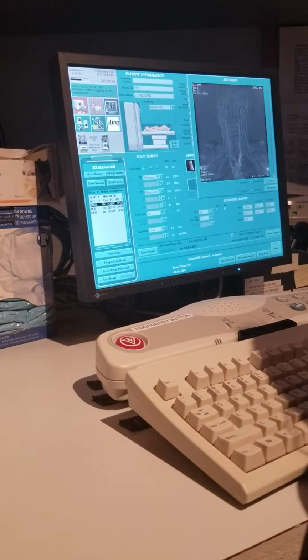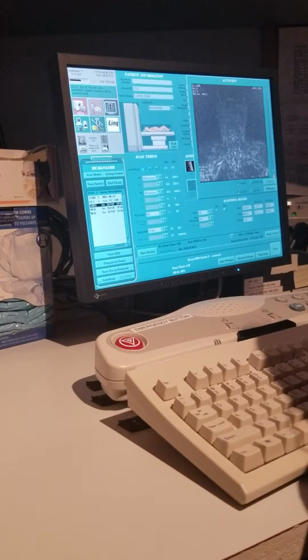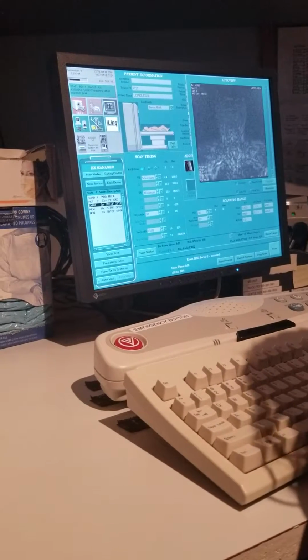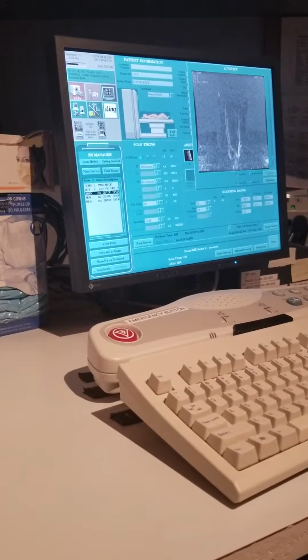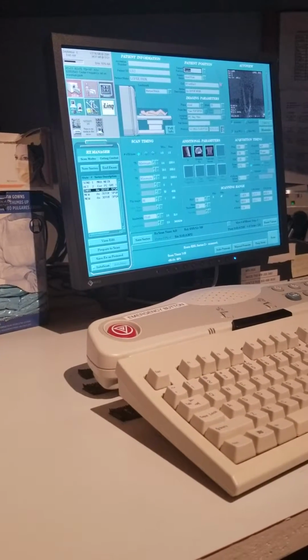Yeah. One more. That didn't come out good at all. What do you think? You think it's because it's one next? Oh, it's this damn coil. Forgot the coil. Oh. Forgot the coil.